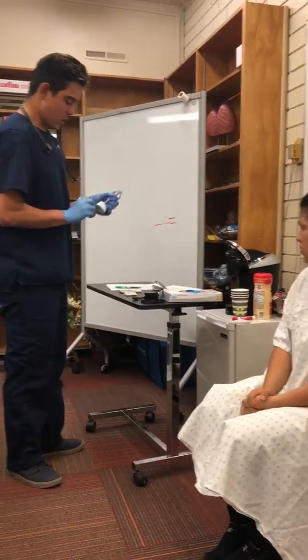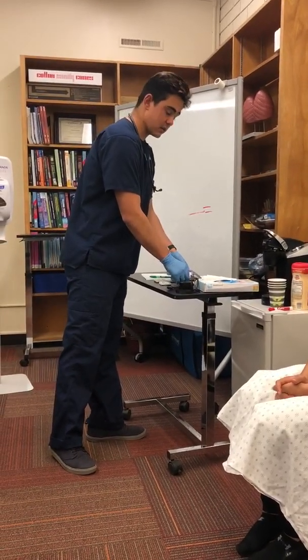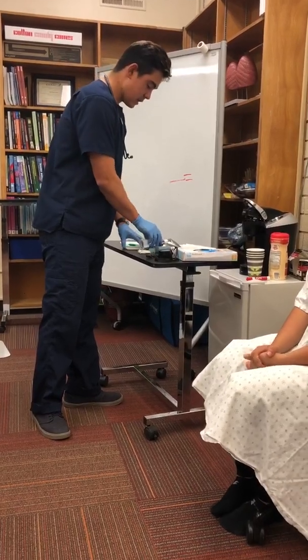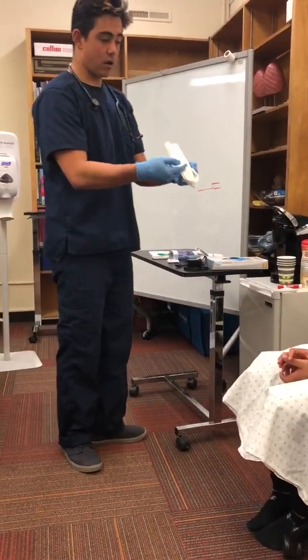I'm going to disconnect it. We'll go ahead and clean this afterwards. If you were to need another dose, a second dose of it, we're going to wait about 1 minute, okay, for the second dose. So now, after a minute or two goes by, I'm going to go ahead and have you cough into this, okay?